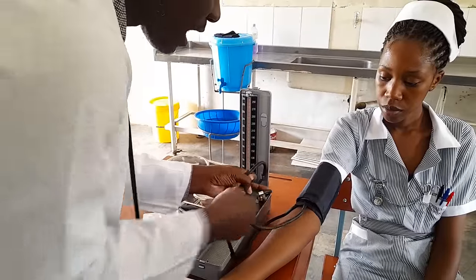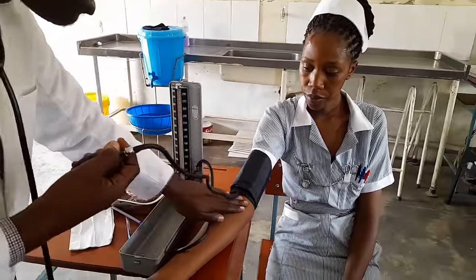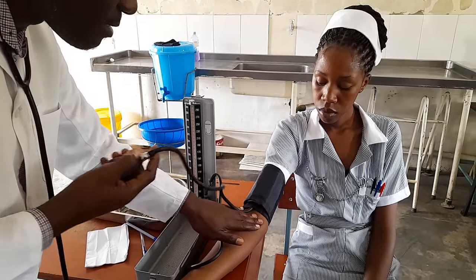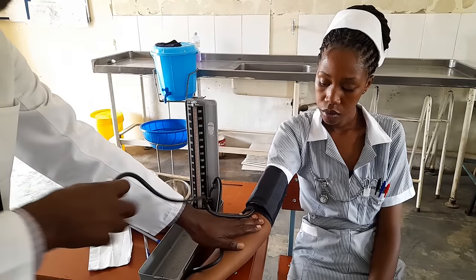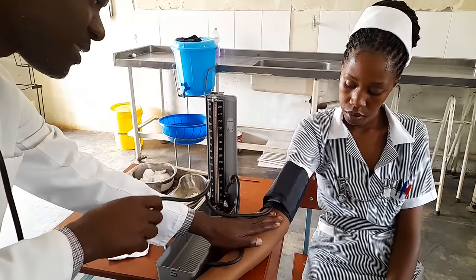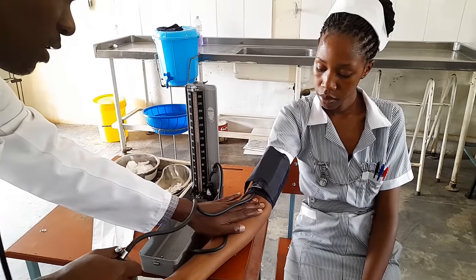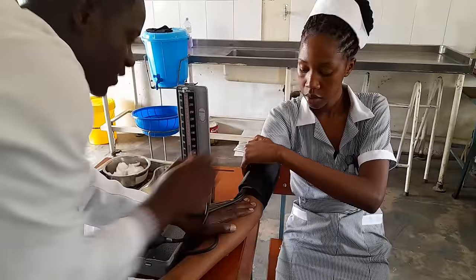After you close the valve, put your fingers at the point where you discovered the brachial artery pulsating. Then try to pump — you'll be able to feel the pulse, and at the same time observe the mercury rising. Start pumping and observe.